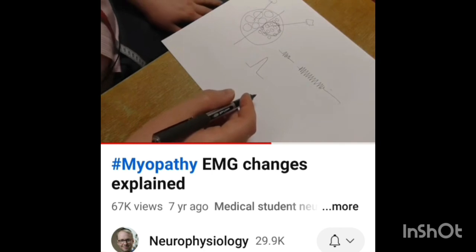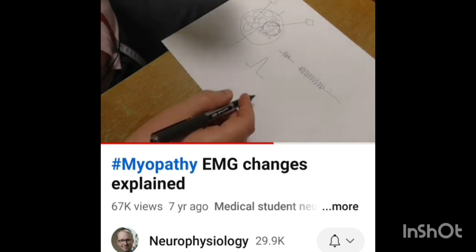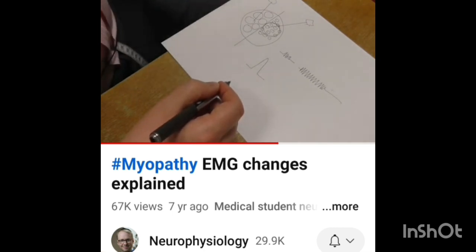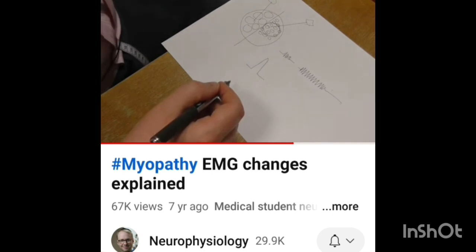The other thing with myopathies that we're looking for is what happens when we're sticking the needle in. Is there irritation of the muscle membrane? And we can pick this up in a number of ways, and we can see fibrillations, positive sharp waves, complex repetitive discharges, and these are all features of myopathy. And in some of the more chronic myopathies, we can also see what's known as muscle fiber splitting, and here we will start seeing some neurogenic changes present as well.